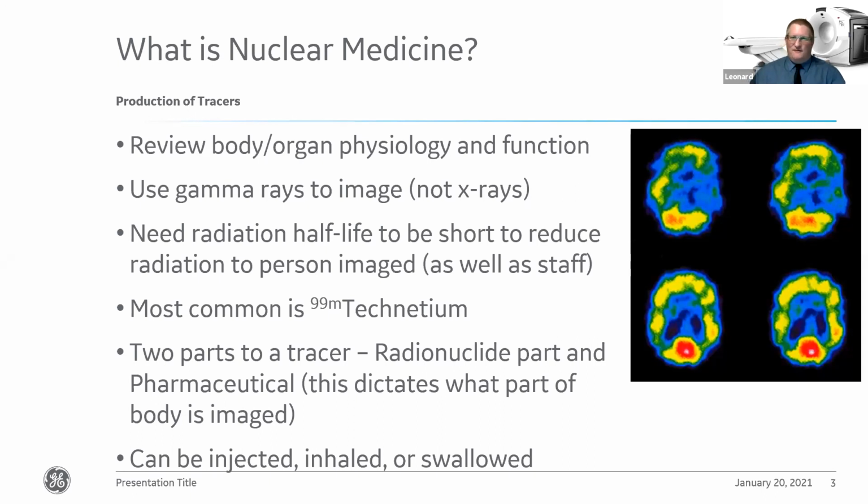So this scan itself, if anybody wants to hazard a guess before I say it, and the main thing on here is really looking at the shape of it from the outline, but it's actually a brain scan. It's an old-fashioned brain scan, looking at how the brain was working. So the other key thing when we're looking at function and physiology of the body is we're not using x-rays.